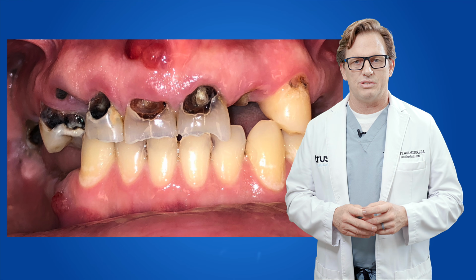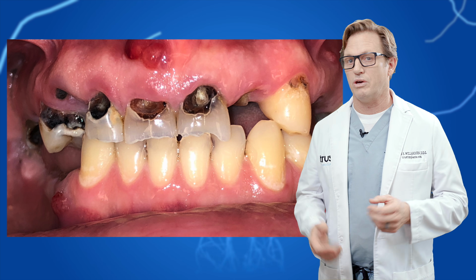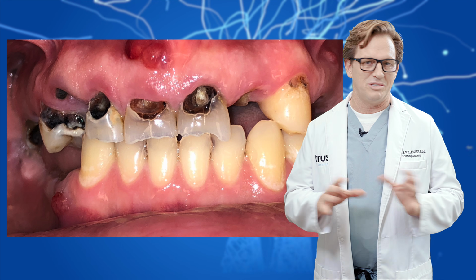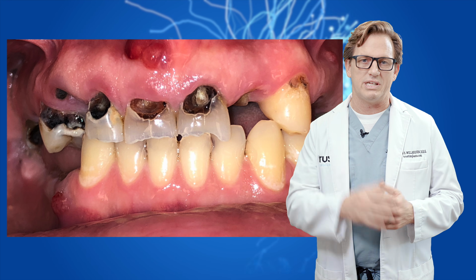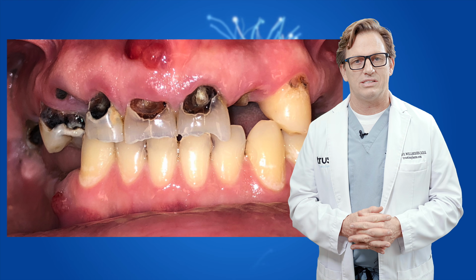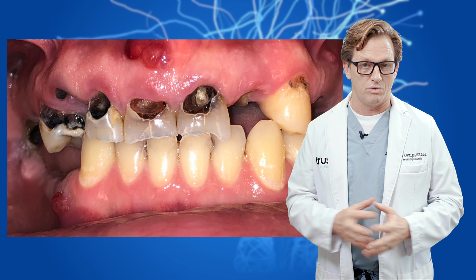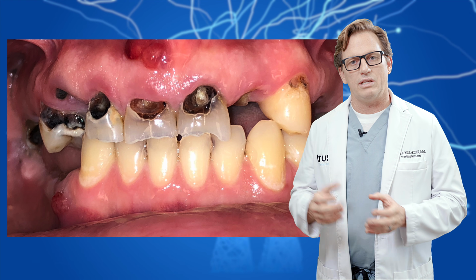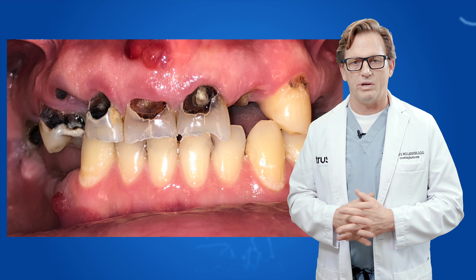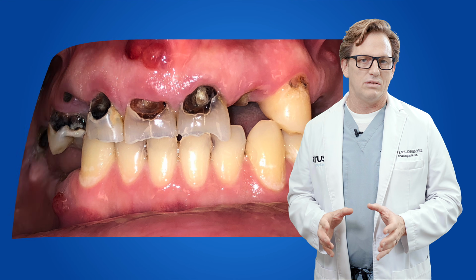So this is a patient who has all three of these factors. You'll notice that there's decay, periodontal disease, and also they're missing teeth. And so the wear and tear on the incisal edge of their tooth or teeth is now to the point where everything has to be removed. And so if we look at here, we have the before photo where you can see all of these things going on, but take a look at the after.